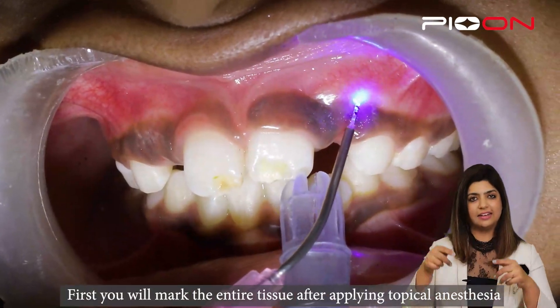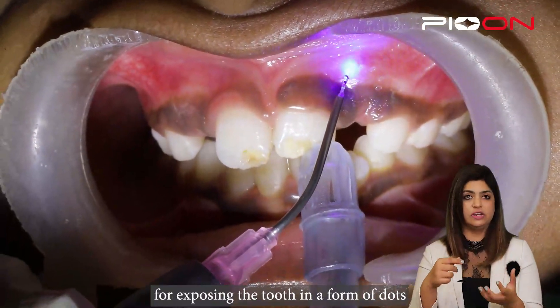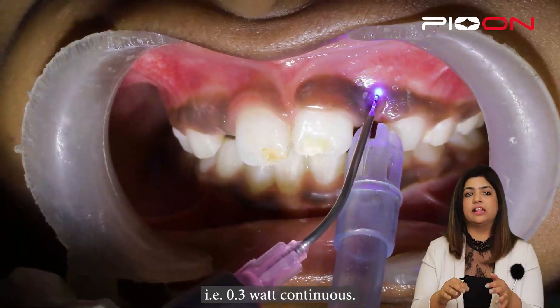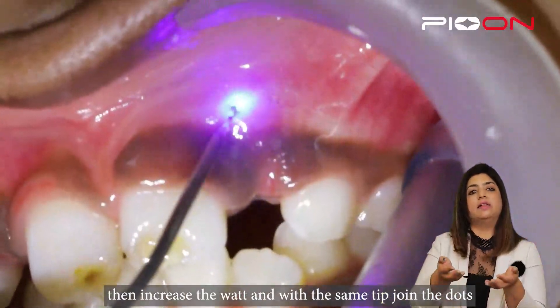First you will mark the entire area of the tooth which needs to be exposed, in the form of a dot, with a very lower wattage — that is 0.3 watts continuous. And then we will increase the wattage.